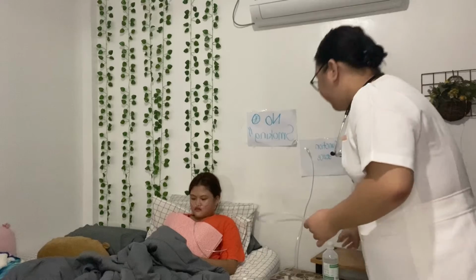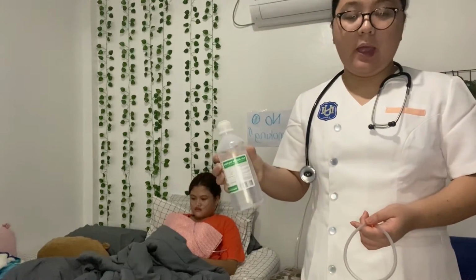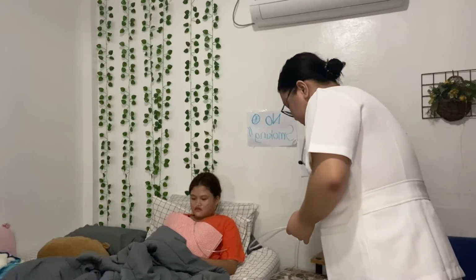So this one is the catheter, and then this is the sterile saline, 100 ml, and I'm going to put it in. And then after that I'm going to apply the sterile gloves to each hand and designate the sterile hand, which is the dominant hand, and the non-sterile hand, which is the non-dominant hand.